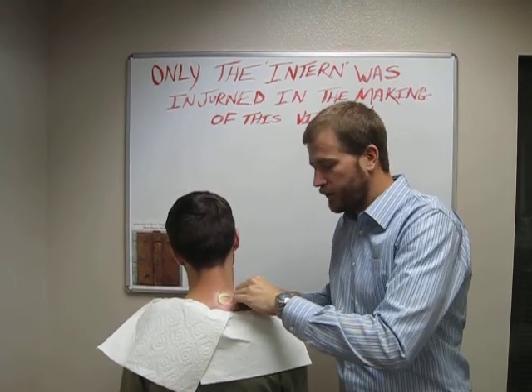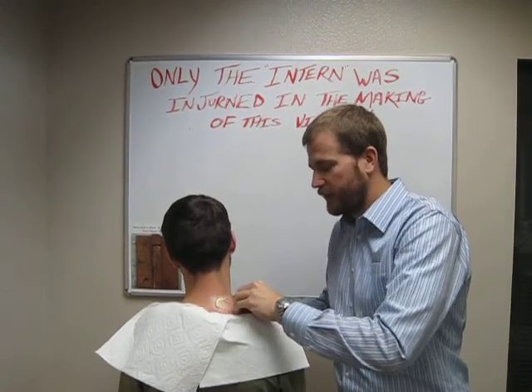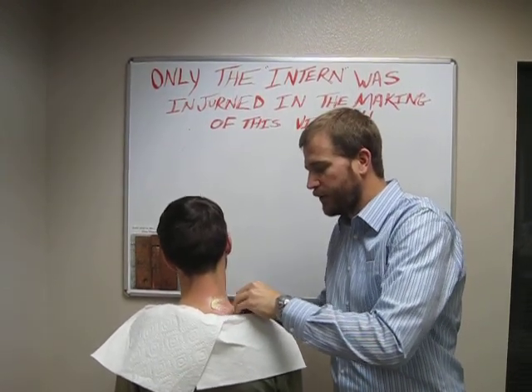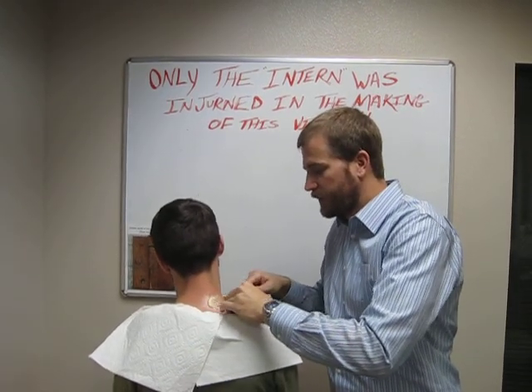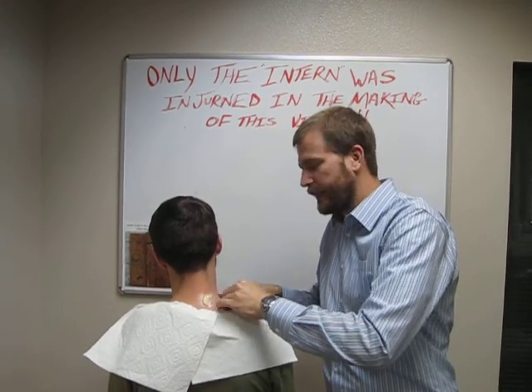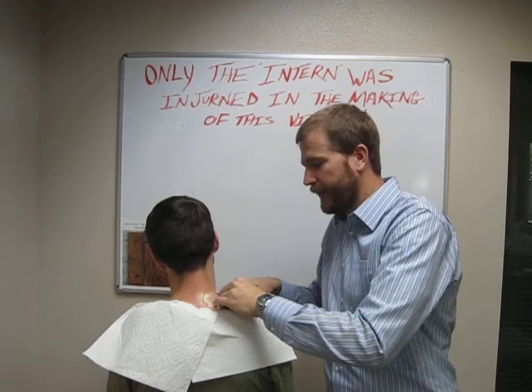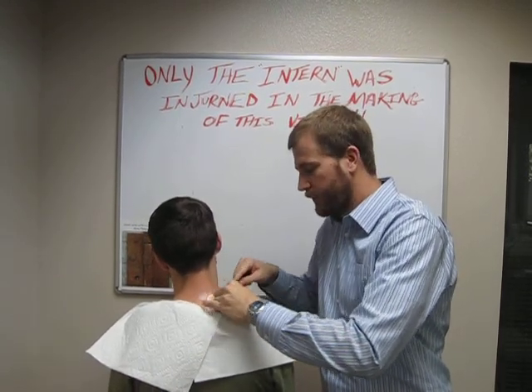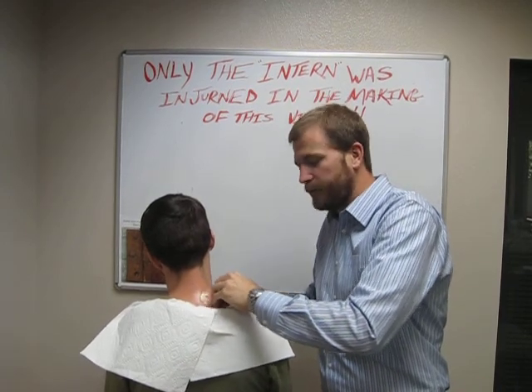What I feel are these little bumps or ridges — it feels like sandpaper as I'm sliding along. That sandpaper feeling is little scar tissue knots that we're going to try and break up. Sliding along the skin, we're going to get these little red dots to form called petechiae. If we get enough of those petechiae together, we'll end up with a bruise. Alex can feel these knots — he can feel those lumps that we're working on.